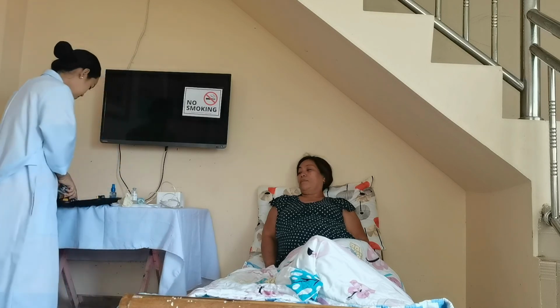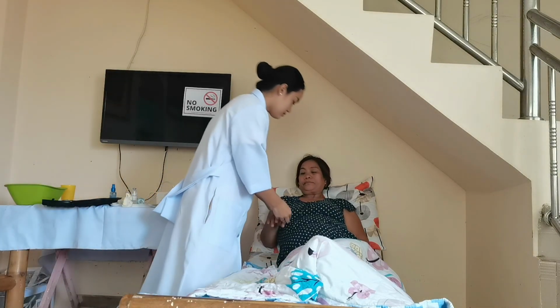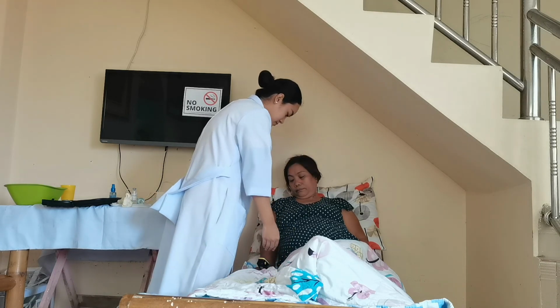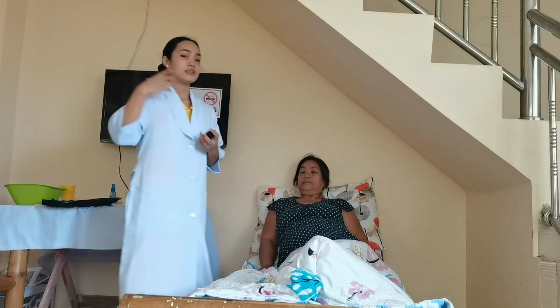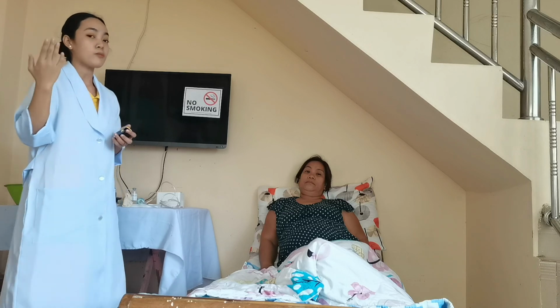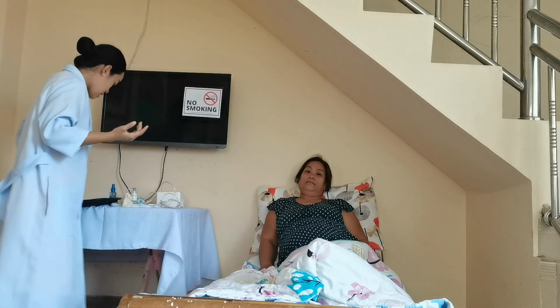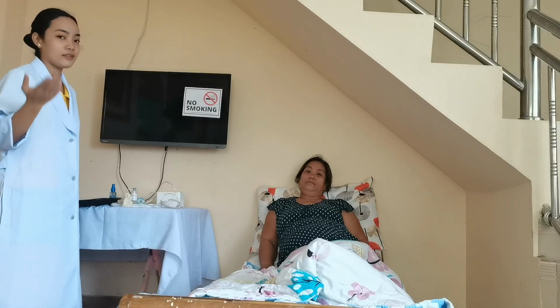Okay pa? So ma'am, check ko lang po ulit yung oxygen niya. So, upon checking the client's lung sound and respiration, there has been an evident improvement. So, before, my client's oxygen saturation was at 94. Now, it has gone up to 96.